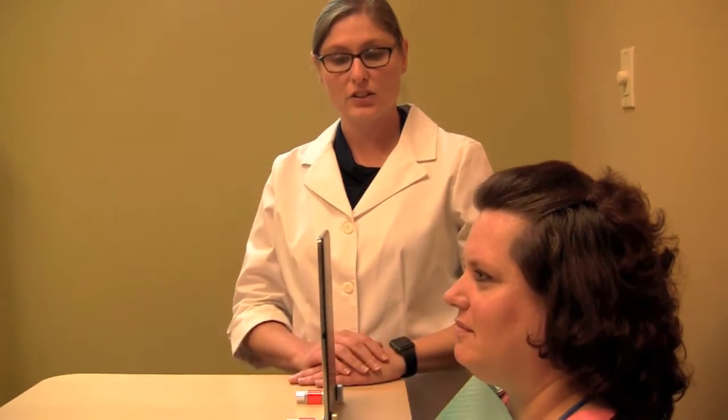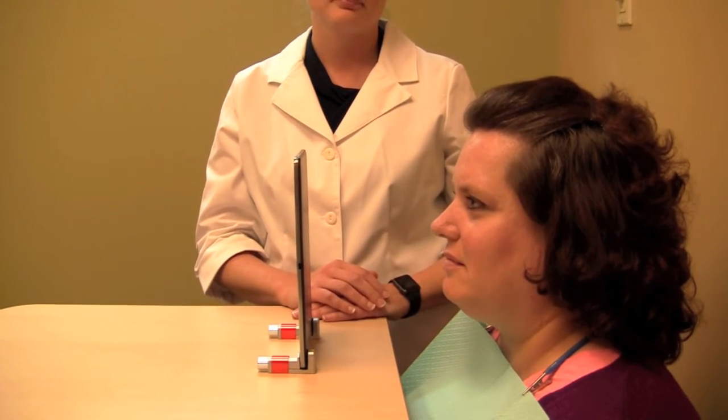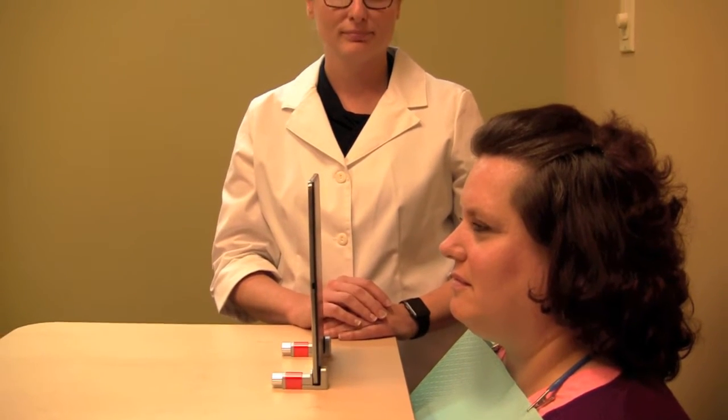To recap, so that Max can get the best image, we want to make sure that Vanessa is sitting and facing forward, her head parallel like she's looking in the mirror, and we want to make sure that we're 8 to 12 inches away, and please notice that the tablet and the patient are parallel. Those are your keys for success.